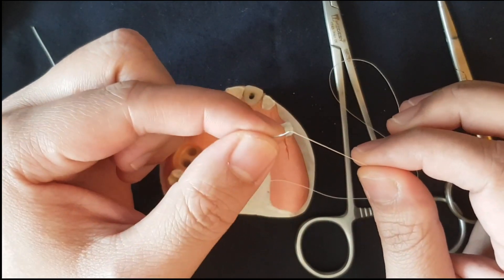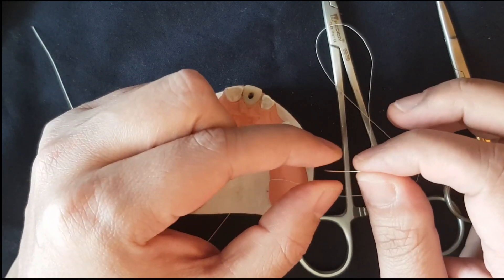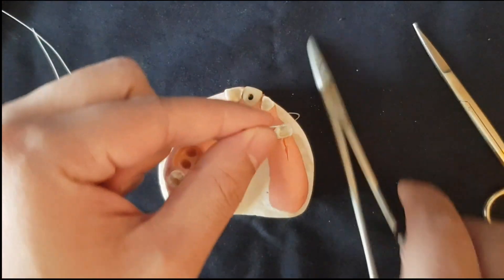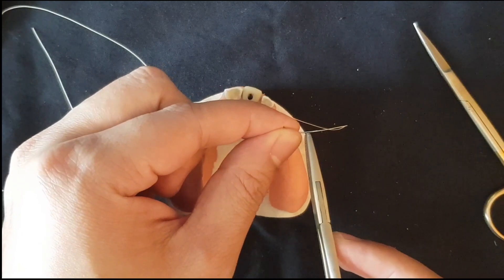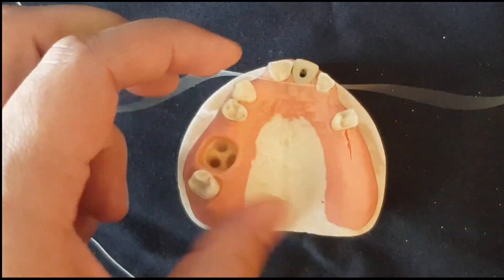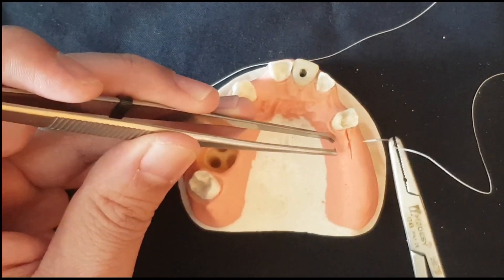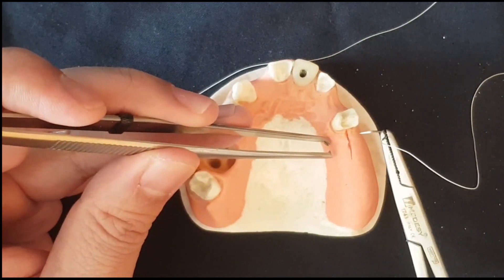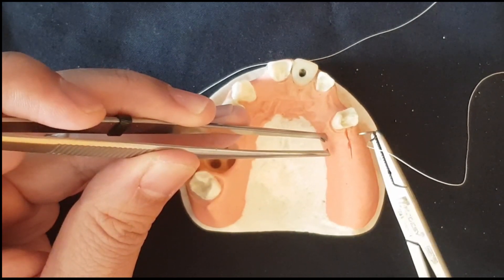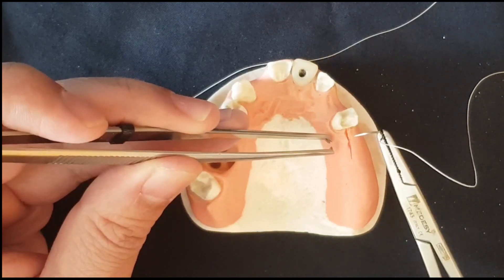The suture we will be using is Vicryl 4-O. 4-O is the thickness of the suture material, and Vicryl Rapid is an absorbable suture material that takes about 2 to 3 weeks to fully absorb in the tissues. When you are holding this needle, try to hold it three-quarters towards the end. I will be showing a simple interrupted suture. The first important point: when you are entering the tissue, be at an angle of 90 degrees to the tissue — not at an angle, like this.